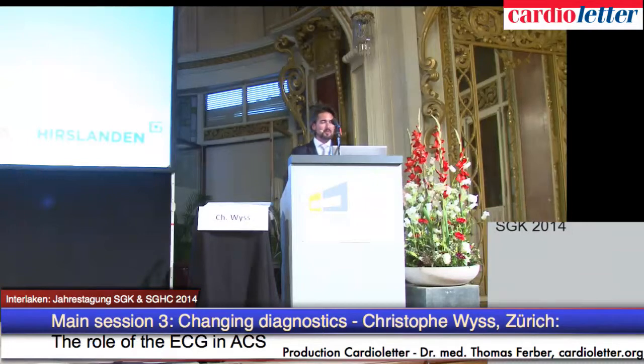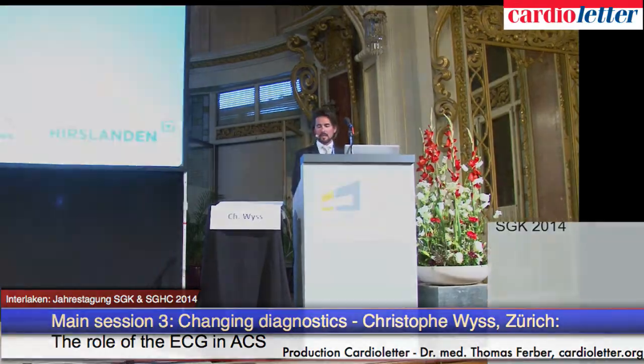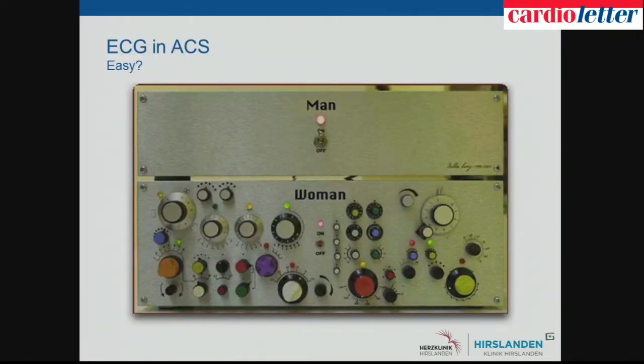Good morning. I would like to speak about the role of the electrocardiogram in acute coronary syndromes. Is it easy to use? Well, let's say there are some things in the ECG that are quite easy to understand and more or less an on-off decision.